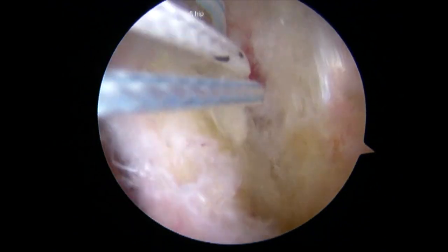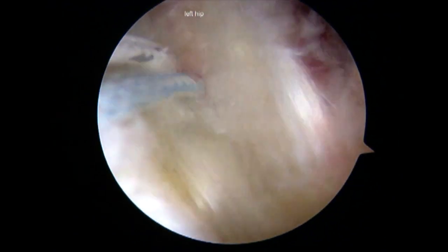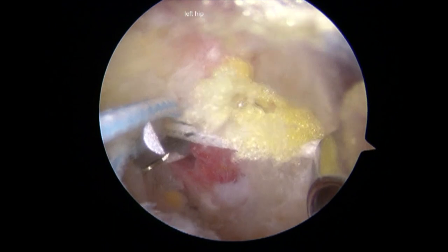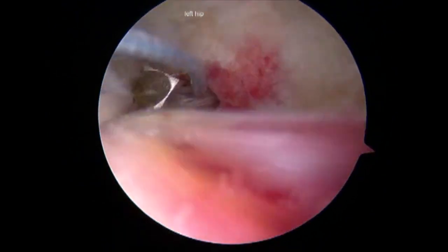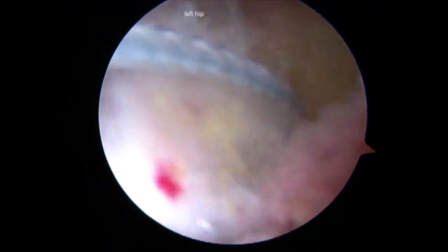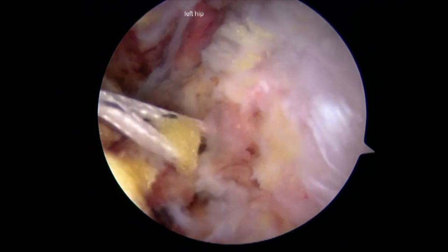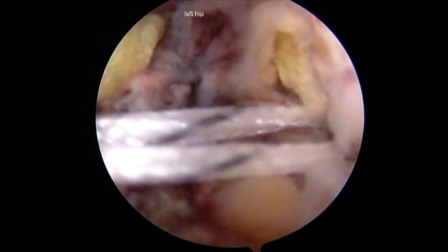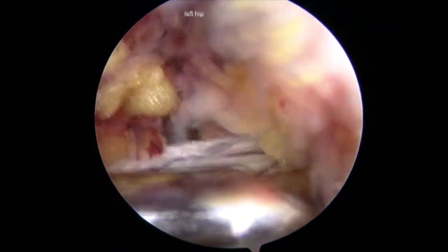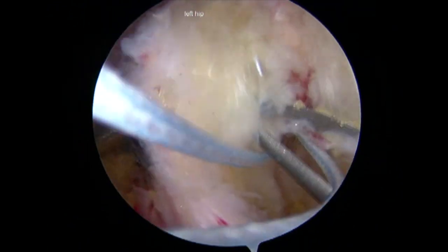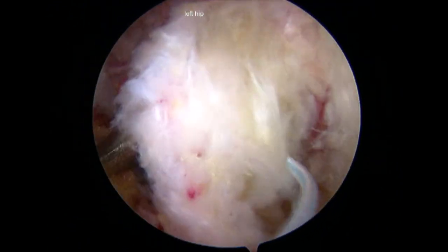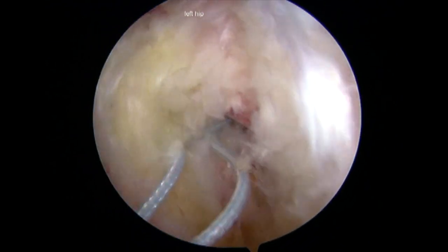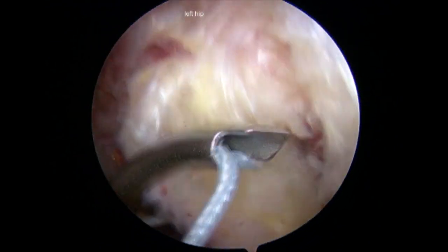The side-to-side repair can be seen as the sutures are passed through the medial and lateral leaflets of the tendon. Arthroscopic knots were used to tie down the tendon to the bone. This is a double-loaded anchor, and a second set of sutures were passed through the tendon for repair.